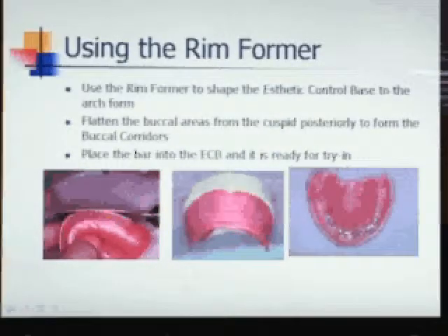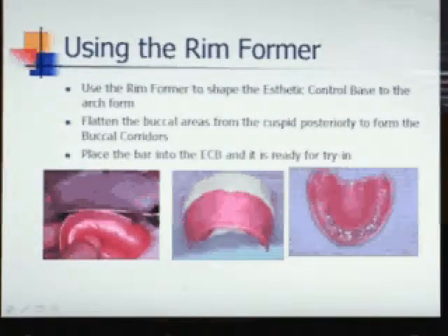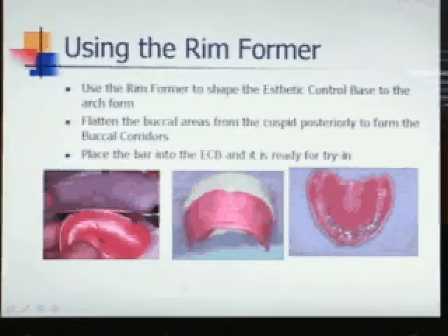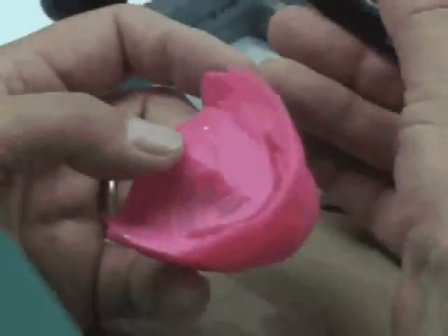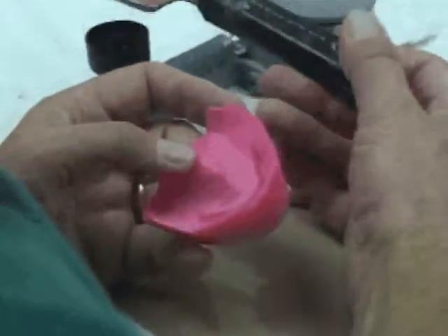Use the rim former to shape the aesthetic control base to the arch form. Flatten the buccal areas from the cuspid posterior to form the buccal corridors. Place the bar into the ECB and it is ready for a try-in. We have a rim former that we warm up, and we're going to use this for shaping the aesthetic control base. It needs to be nice and hot.